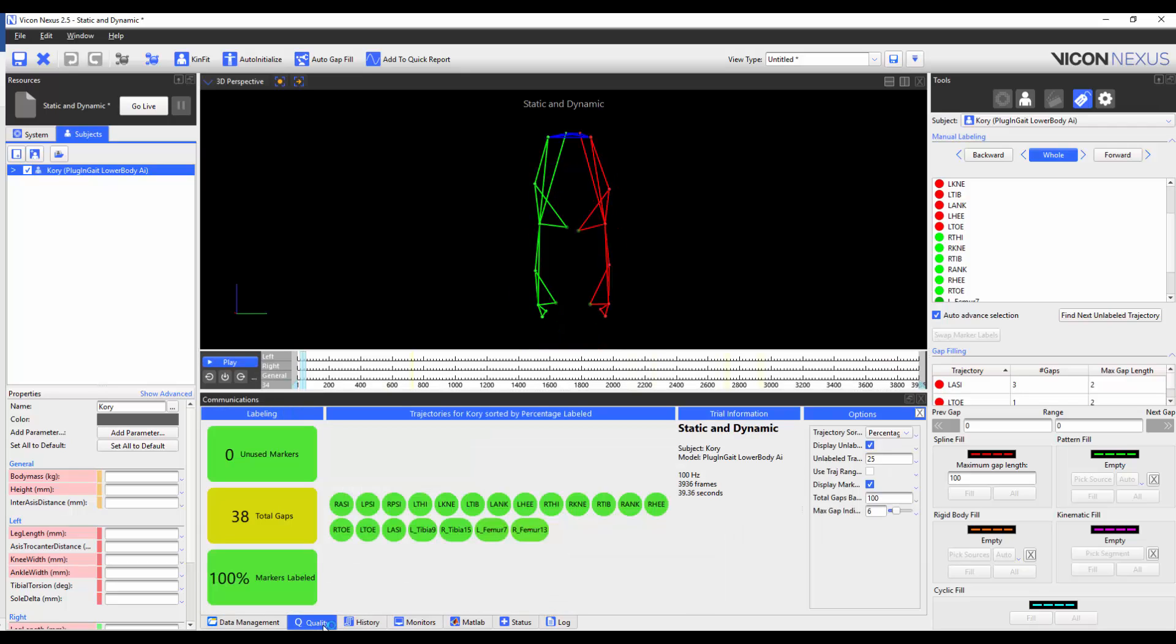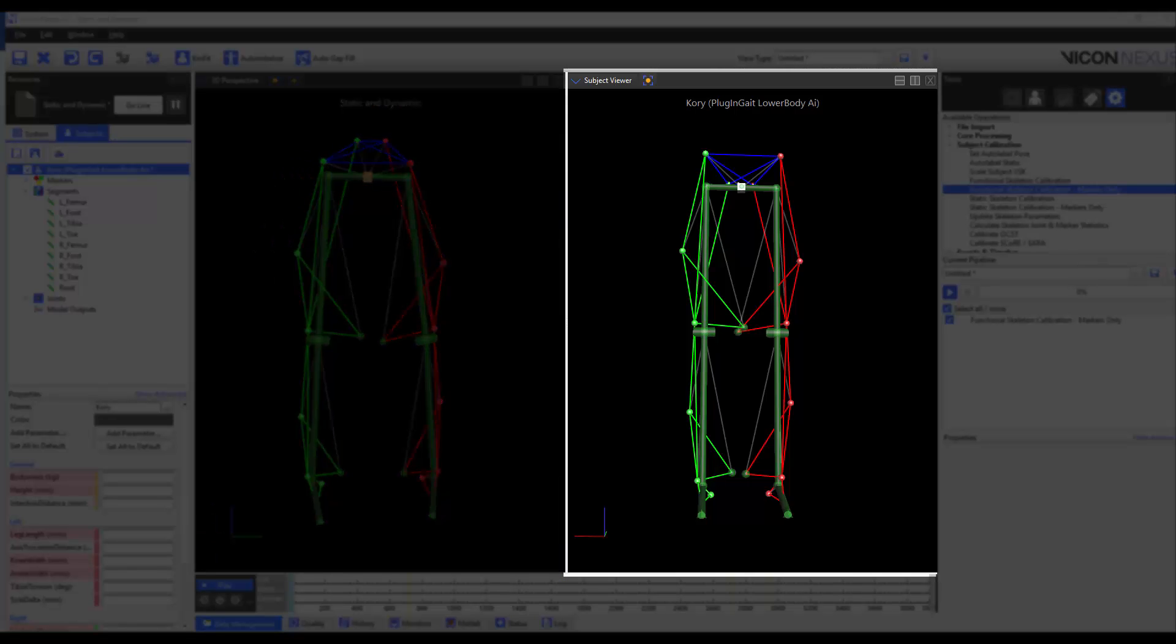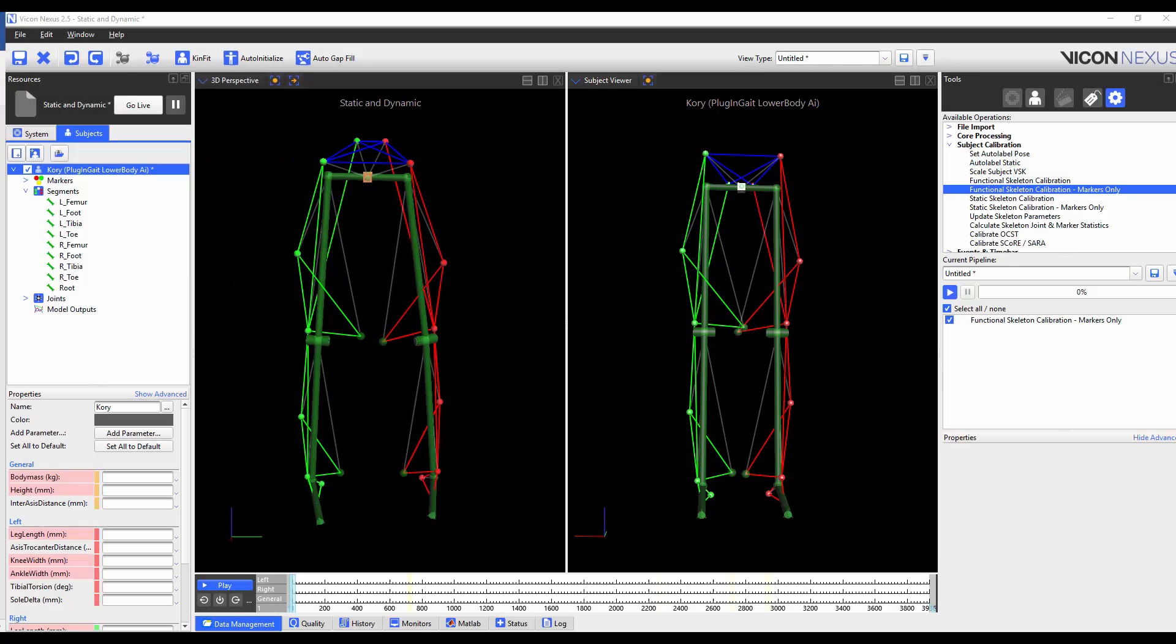Although there are still gaps, we do not gap fill. We can see in the subject viewer that my left and right medial knee markers aren't correctly aligned. To fix this, I'm going to run the functional skeleton calibration markers only pipeline operation. I've chosen the markers only functional calibration because I want to keep the joints in the same position but to reposition the markers around the joints.